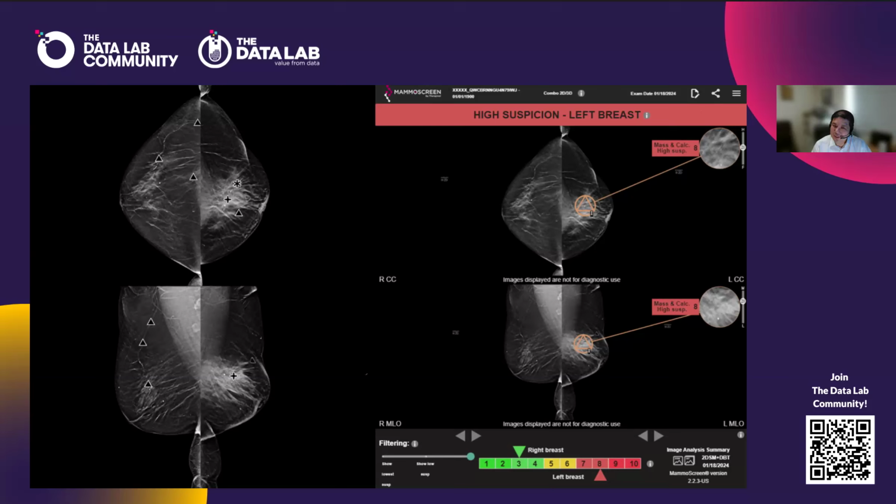So to data people, sensitivity, specificity, we want more specific if we can, because it reduces the number of false positives. And with the AI models that we have now, we are much more specific. We usually identify one or two areas. We can give you a percentage score usually, and that says whether it's suspicious, and even characterization of the lesion that we're looking at. Why is it suspicious? So a bit of that black box explainability.